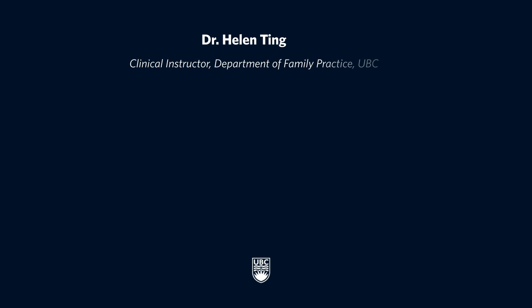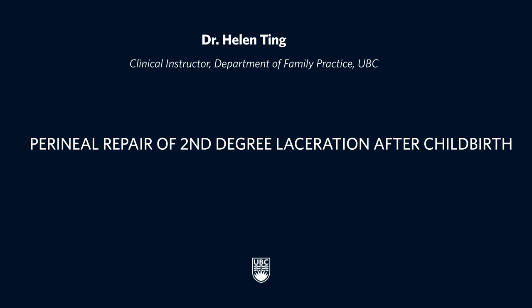Hello, my name is Helen Ting. Today we're going to practice repair of the perineum with suturing equipment and a foam block.